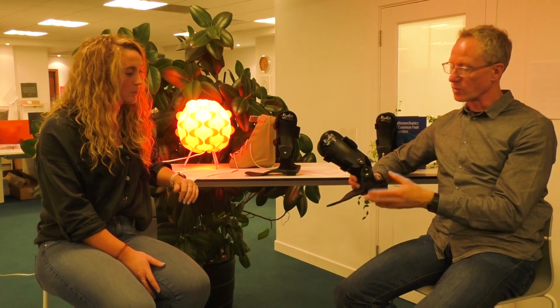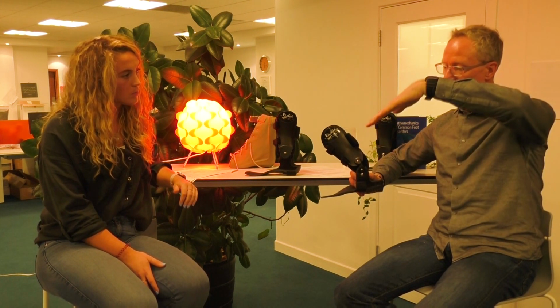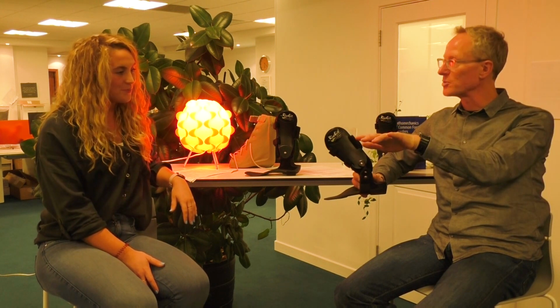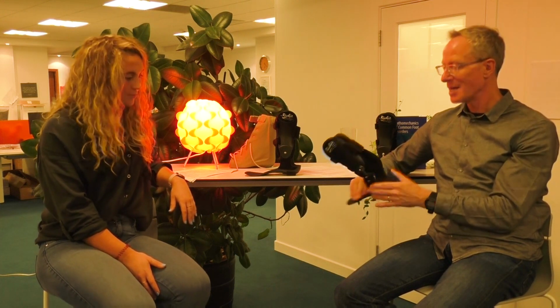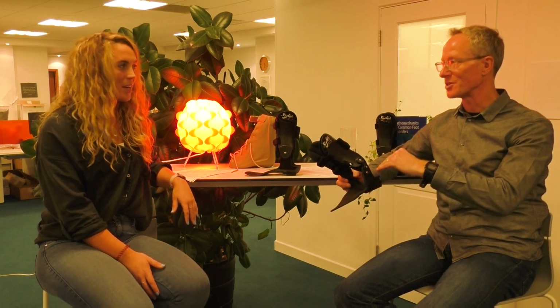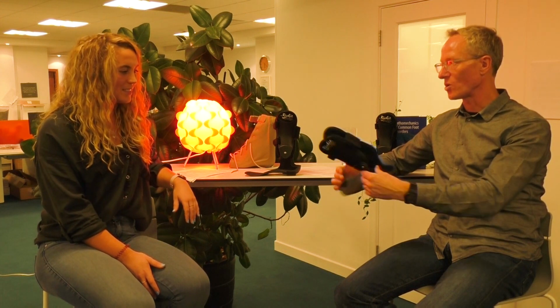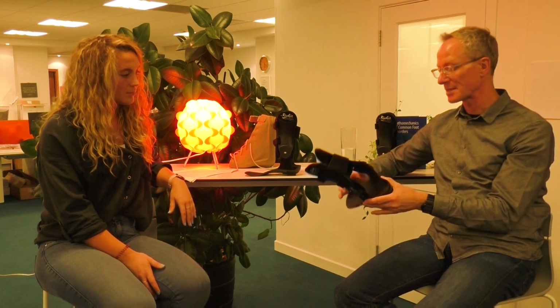Yeah, and what sometimes happens is that if you watch the foot unloading, so they load the forefoot, and that's when you'll see this frontal plane collapse and abduction of the forefoot. Yeah. And that's when you need the custom-made Richie brace. I mean, we do have a version of an OTC Richie brace, which is a flat foot plate, but I just don't use it. Don't use it. For the difference in the cost to get the custom made. Yeah. Just doesn't make sense. No. And I've used it a few times and failed compared to when I've used the custom made foot plate.